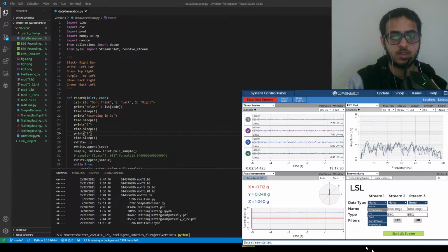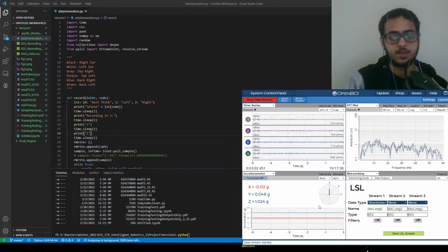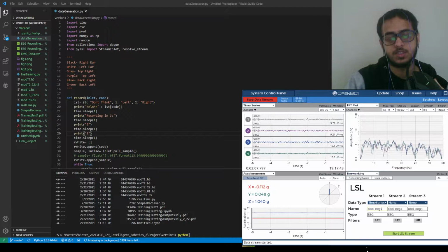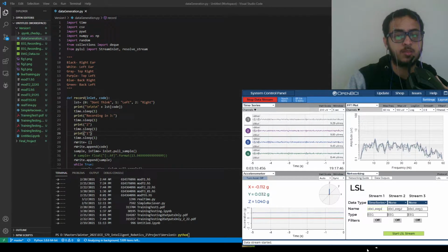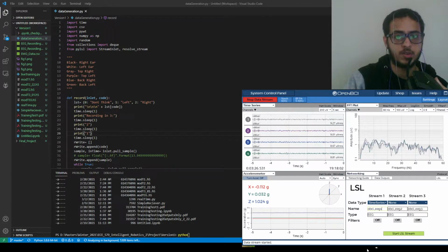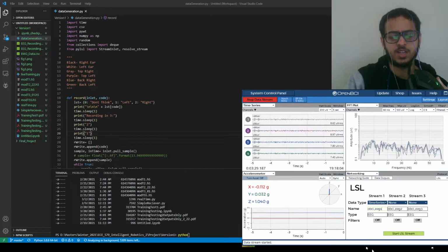I pass this signal over an LSL channel to my Python software for collection of data. After collecting the data, it is saved in a CSV file, and that data is later processed using wavelet transformation, continuous wavelet transformation, to get a time frequency analysis. And using that analysis, we train a convolutional neural network model and try to predict what I am thinking.